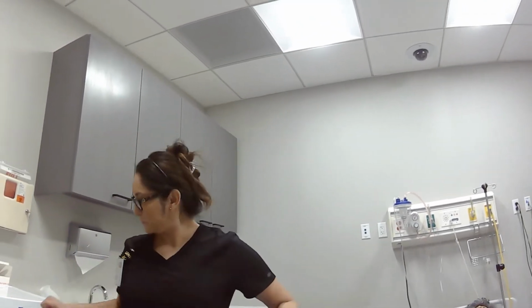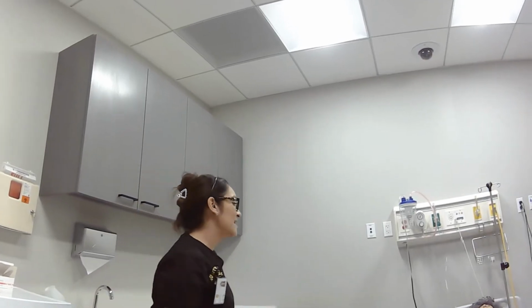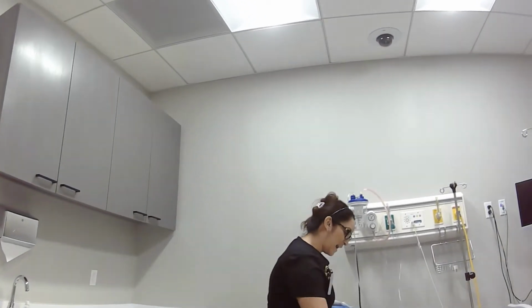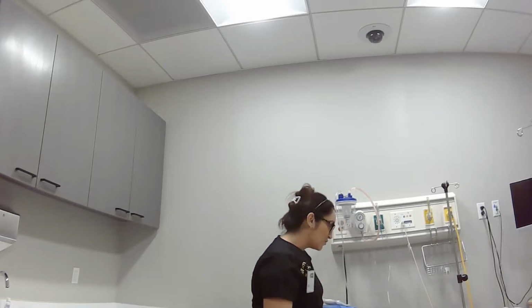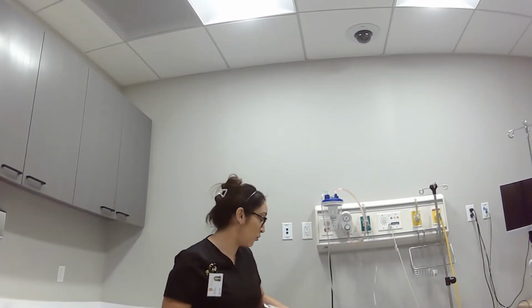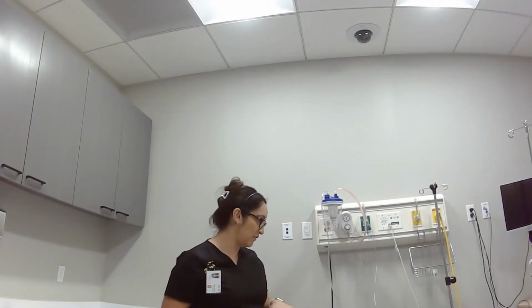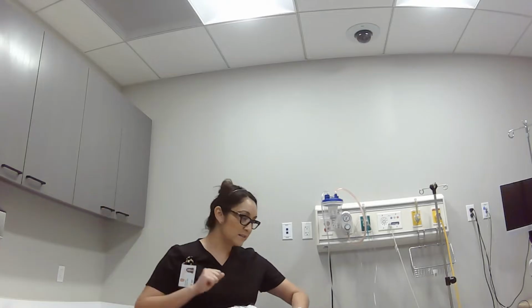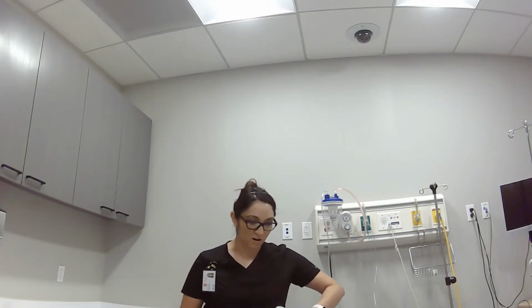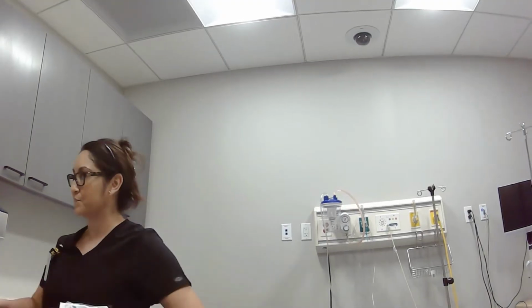I am coming into my patient's room. Knock, knock. Hi, Miss Adams. Yes, hi. I'm Cynthia. I'm your nurse today. So Dr. Forbes has ordered a Foley to be inserted, okay? So I'm going to go ahead and get all of that ready. I'm going to do some hand hygiene before I get started, okay? And then get some gloves, and then I'll explain everything to you.